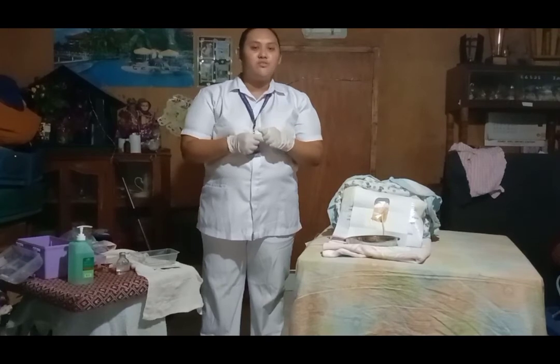So, secure the indwelling catheter by taping it to the patient's thigh, allowing some slack in the tubing to accommodate the patient's movement. The thigh is the best area to tape the catheter in females, and in males it would be the abdomen.